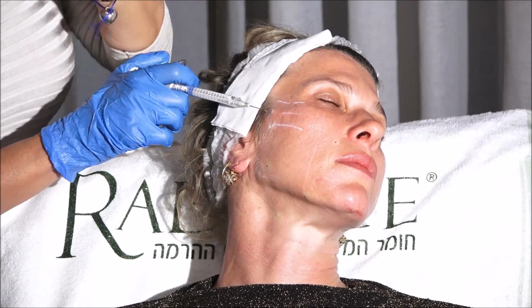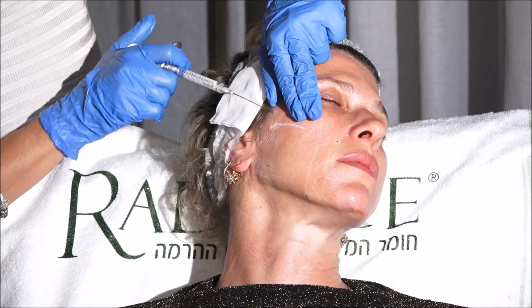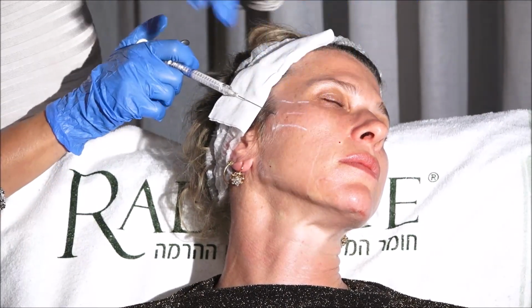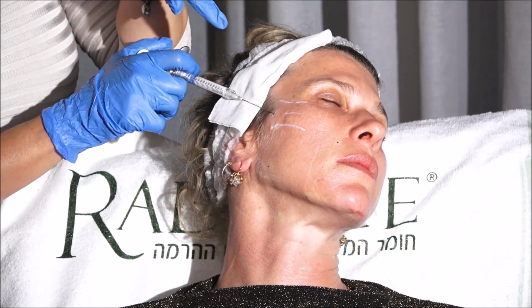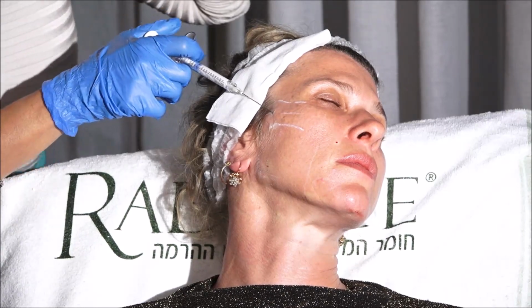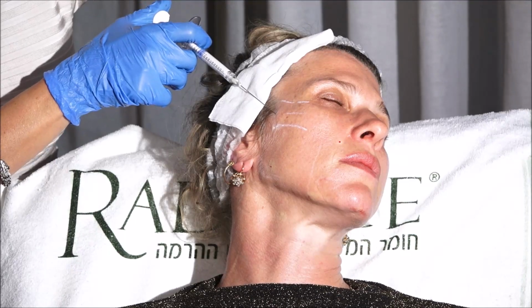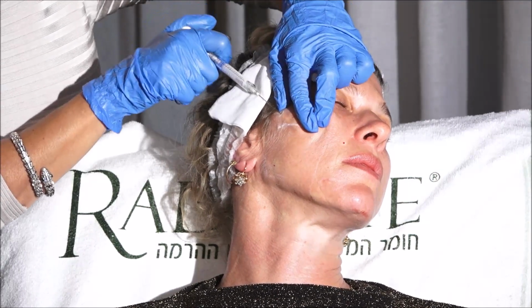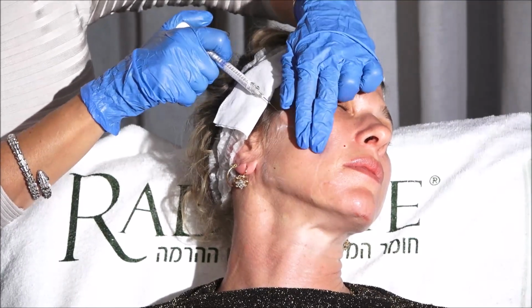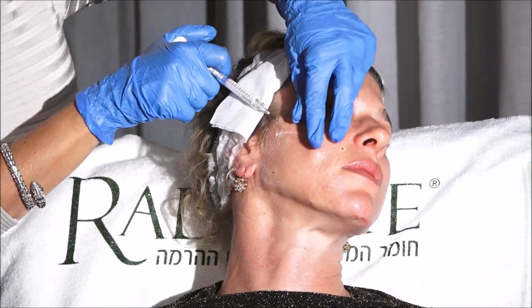You have to feel the resistance. In patients with acne scars, a little bit like her, she has some ice picks, you even feel more. It's interesting, because with post-facelift patients, when you do that, it glides. Face, neck is a nightmare, but face, as the plane is there already, it glides like butter. If you're not feeling the resistance, you're too deep. You have to feel, because you have to cut through this mass, right?